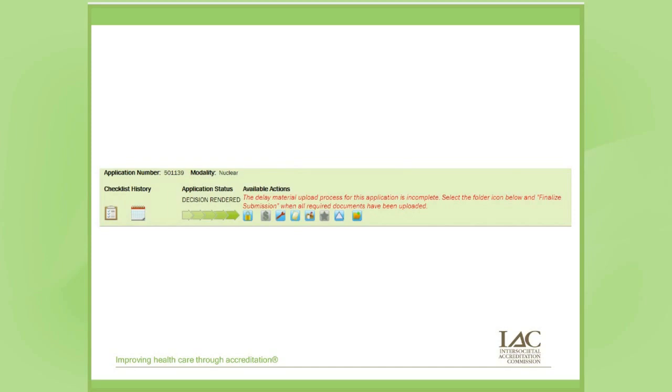Sure. So it is helpful to upload everything from your PAC system because you don't want to leave anything that might be proprietary to viewing something. If you're really nimble with it, you could probably pick through and just pick the images. But I say whatever your PAC system wrote to your disk is probably what you want to upload to our system, just to be sure that we can view the images.